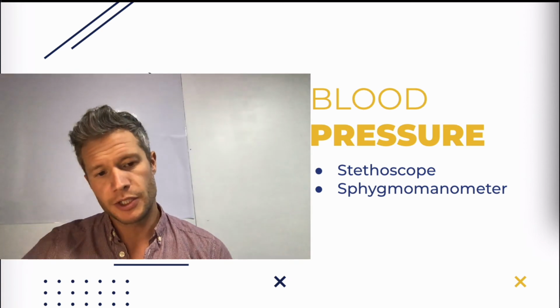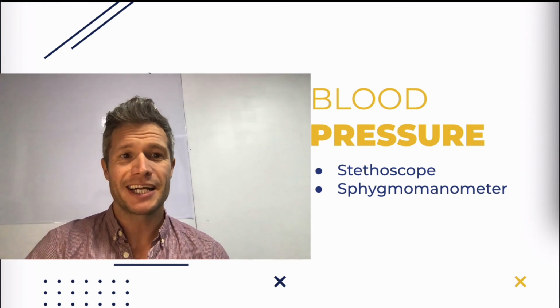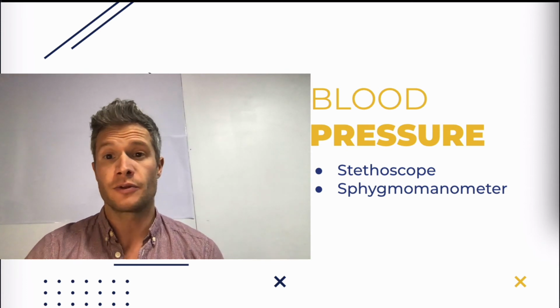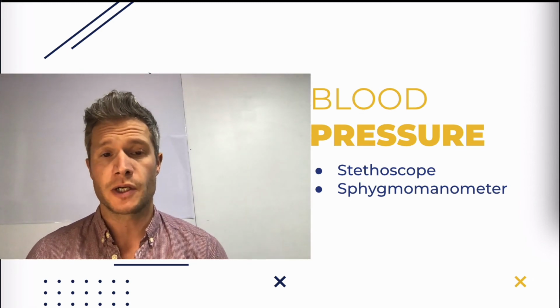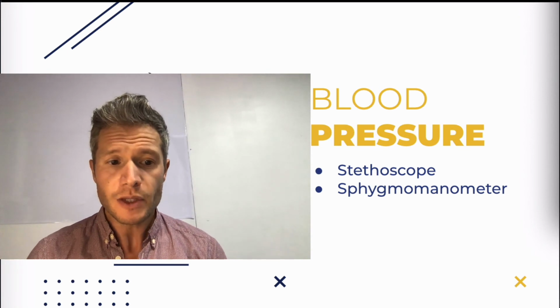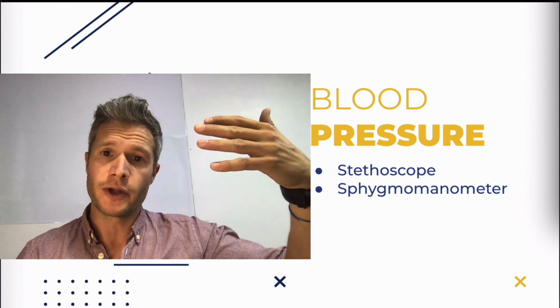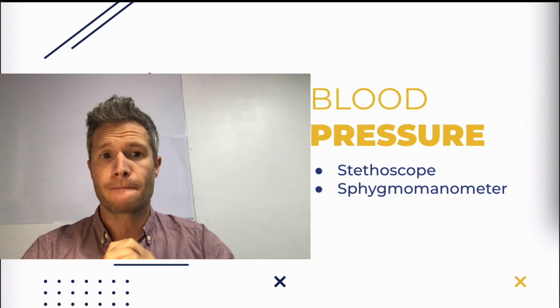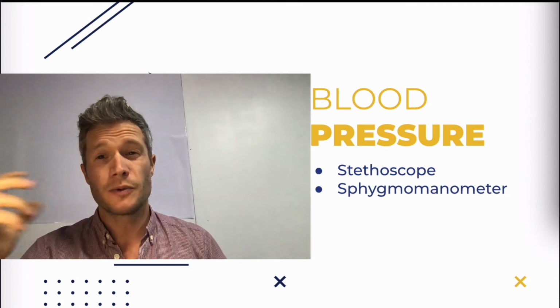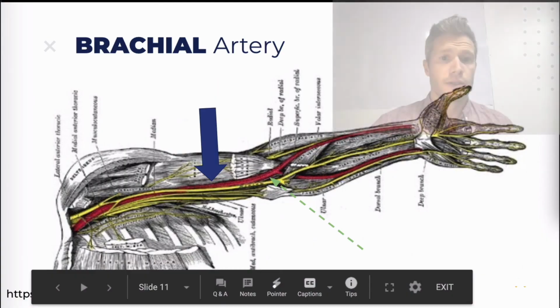We're going to switch to kind of seeing the anatomy a little bit first, so what's going on. Again, I highly suggest taking a look and reviewing the tutorial that's linked to this, both in the video and also within your course content under the learning module for this week. It really helps explain and connect when the blood pressure is going up, what the cuff is doing to your artery and your blood pressure, what you're listening for, what you get to hear, and then where you generate the numbers for systolic and diastolic.